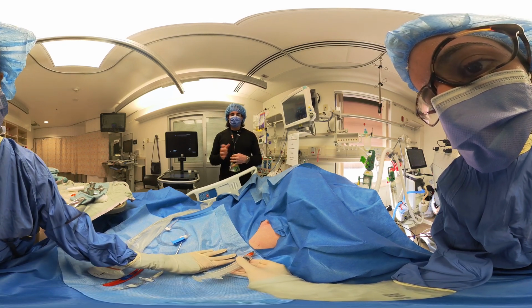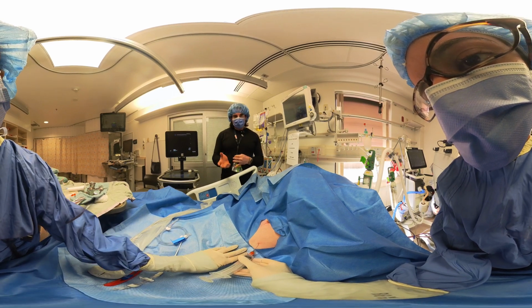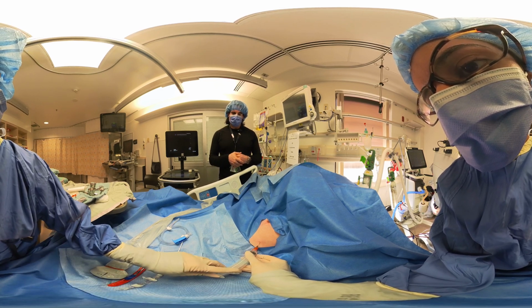Now we'll aim directly for the rib. Okay, so we aim for the periosteum. We freeze the periosteum. And then we pass just slightly over the rib.